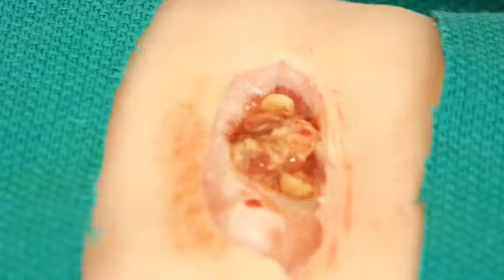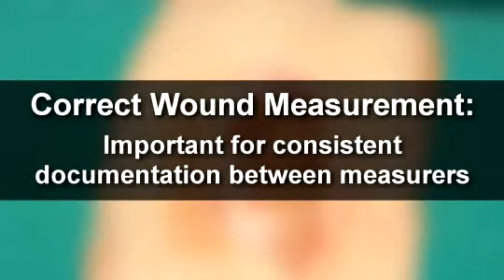It is important, however, that length and width are correctly measured and documented, as the convention from head to feet for length and left to right for width are important in being able to reproduce measurements between measurers.